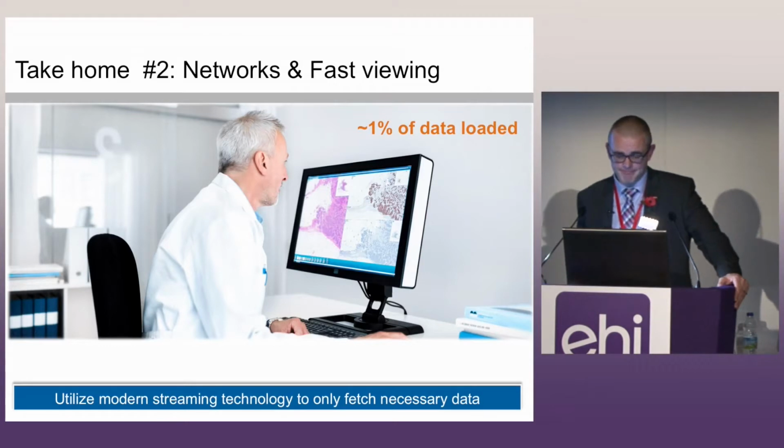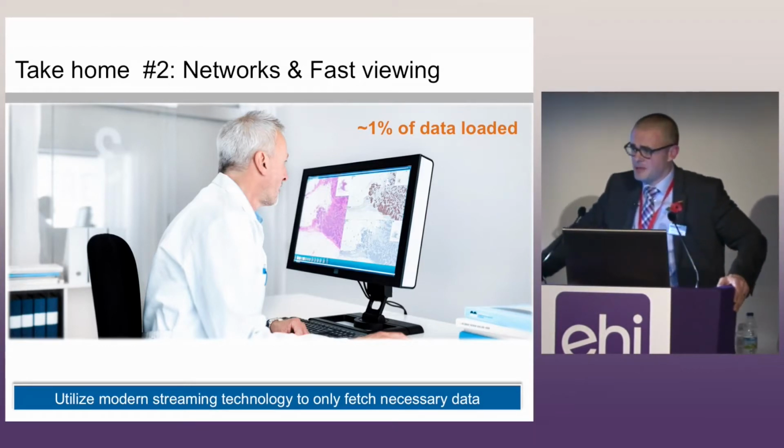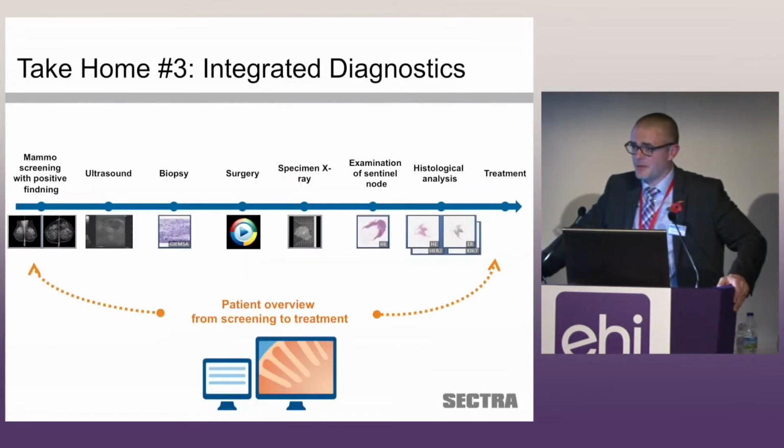And of course, secondary to that is for the technology to be adopted by the health professionals, it needs to be quick. A pathologist does not experience any lag when looking down a microscope today, and would expect none when looking at a digital platform. So that data footprint in terms of what is passed over the network is extremely important.